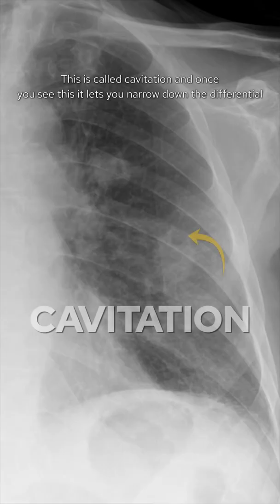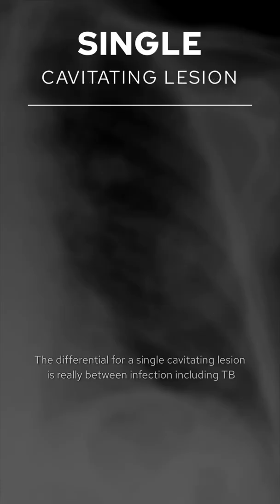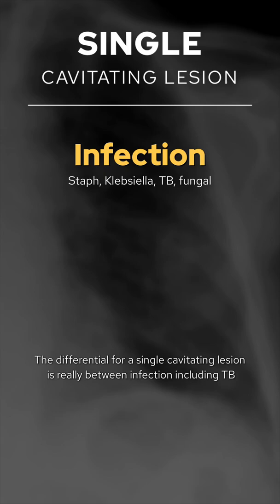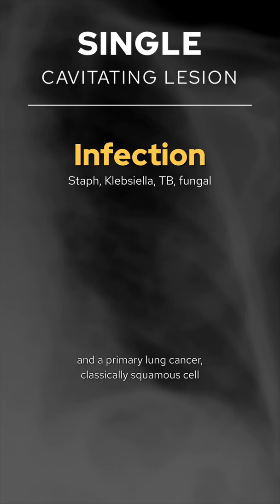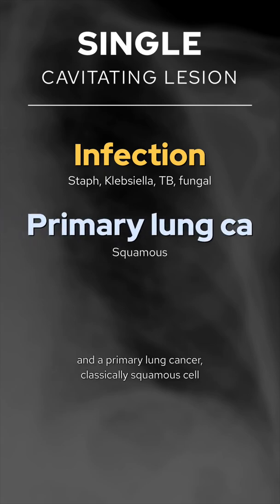This is called cavitation, and once you see this, it lets you narrow down the differential. The differential for a single cavitating lesion is really between infection, including TB, and a primary lung cancer, classically squamous cell.